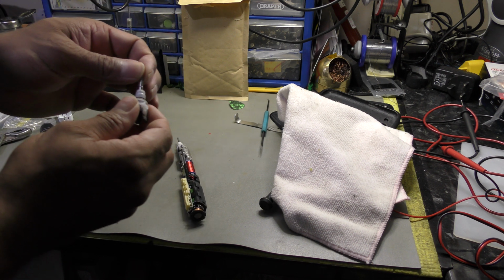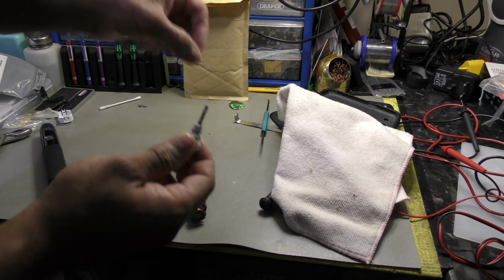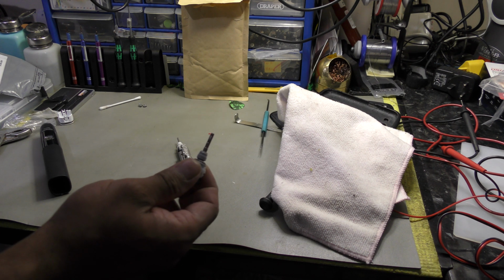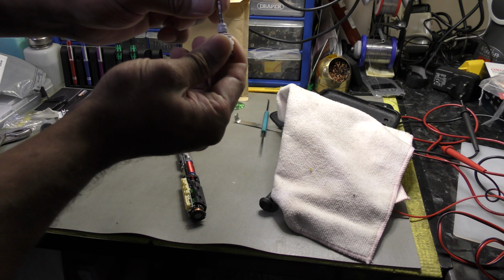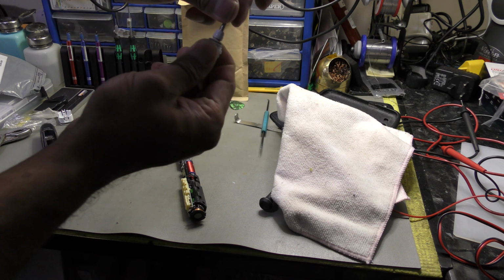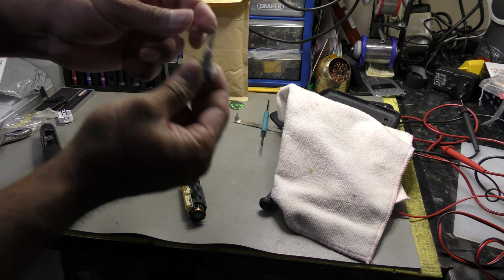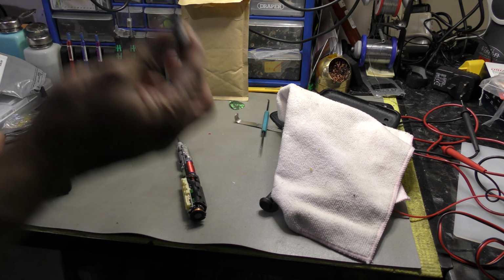So just pretend like you're wiggling around in a car with the gearbox and the clutch is down, and you're wiggling it, you're putting it in a position. It'll sit in that position. That's exactly what it's doing. If you push it left, it'll sit in the left. If you push it right, it stays right. But actually, the behavior of this tip is basically to centralize. Okay, and that's not what was happening.